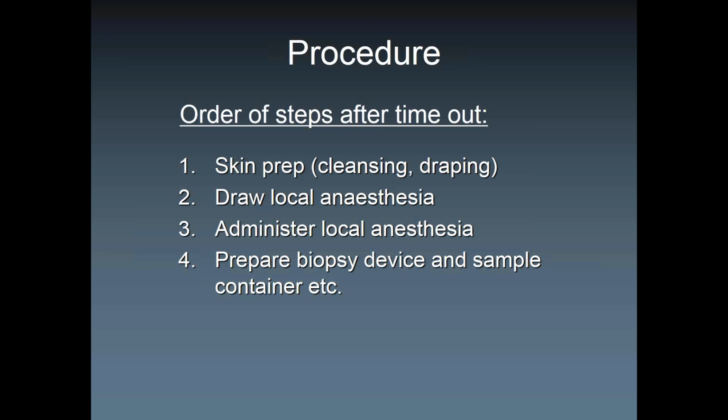So every second almost counts with lidocaine and the buffer. And if you don't take advantage of that, just because you want to be efficient, the patient's going to have pain, and you don't want that. It would be unfair, right? It's not an intentional thing, but often people are not aware of that. So you start with the skin prep, provided that you have your table set up, all the instruments are on board.